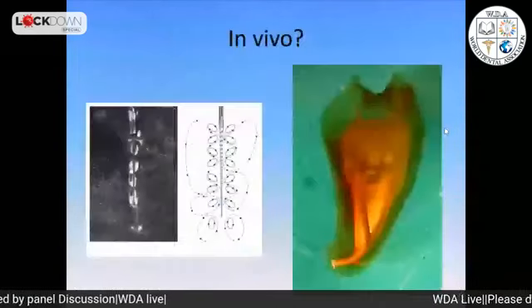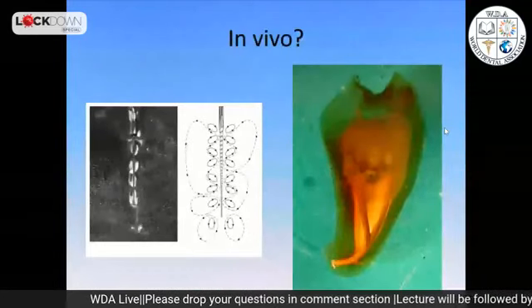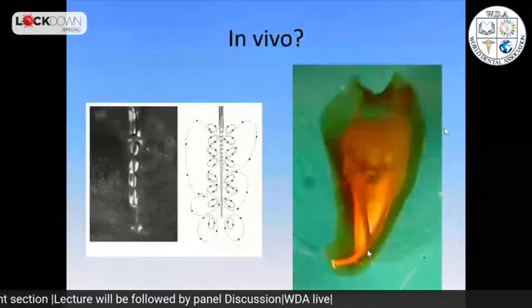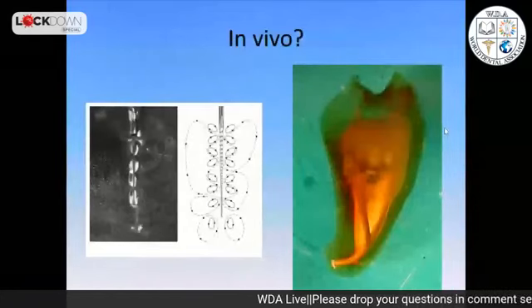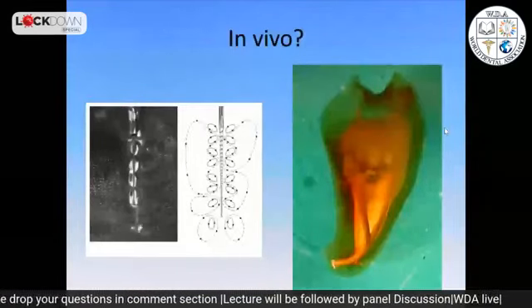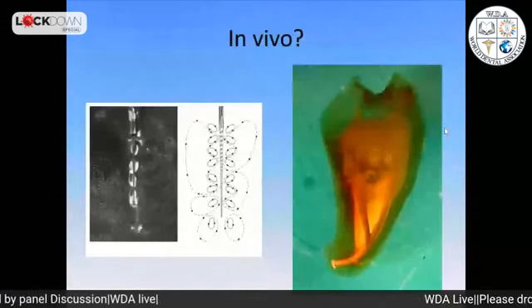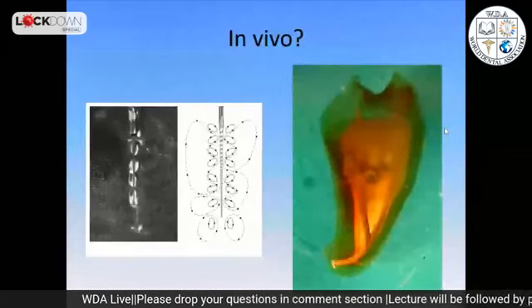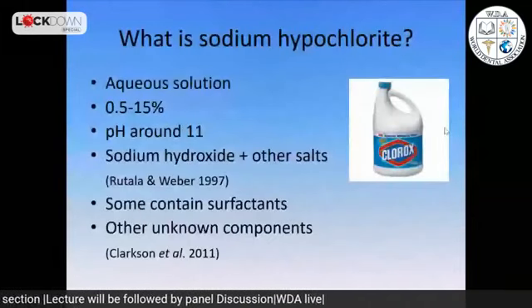Now, I always ask myself, will this really happen if I'm inside the root canal? Let's say this root, where we have two canals that merge apically: will the ultrasonic tip be free enough to allow this sort of movement? So perhaps we have some action, but it's a little bit limited by the fact that we are working inside a tooth. There are some physical restraints. So what happens is that maybe sonic and ultrasonic do not have such a big difference, but this is all in vitro. We always need to think that we are agitating, but what are we agitating?